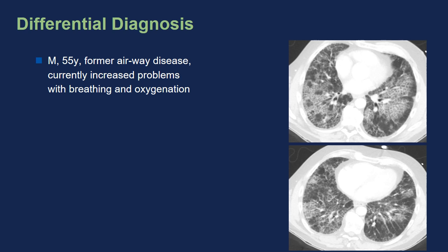Looking at differential diagnoses, I present a 55-year-old male with prior airway disease and currently increased problems with oxygenation. Here we also see reticulation from intra- and interlobular septal thickening, with totally normal secondary lobules adjacent, and ground glass opacity visible on both sides. In this patient we are dealing with an influenza A virus infection, which can also lead to the appearance of crazy paving.